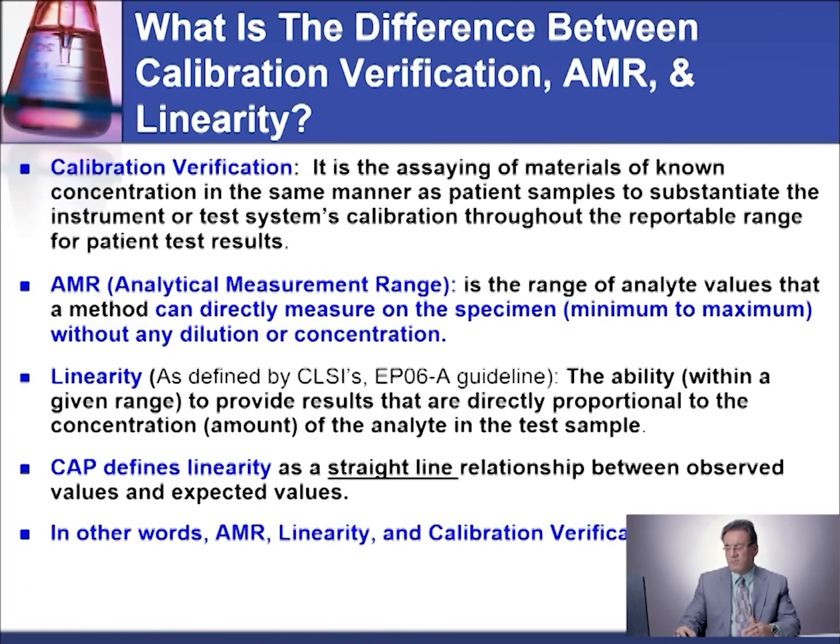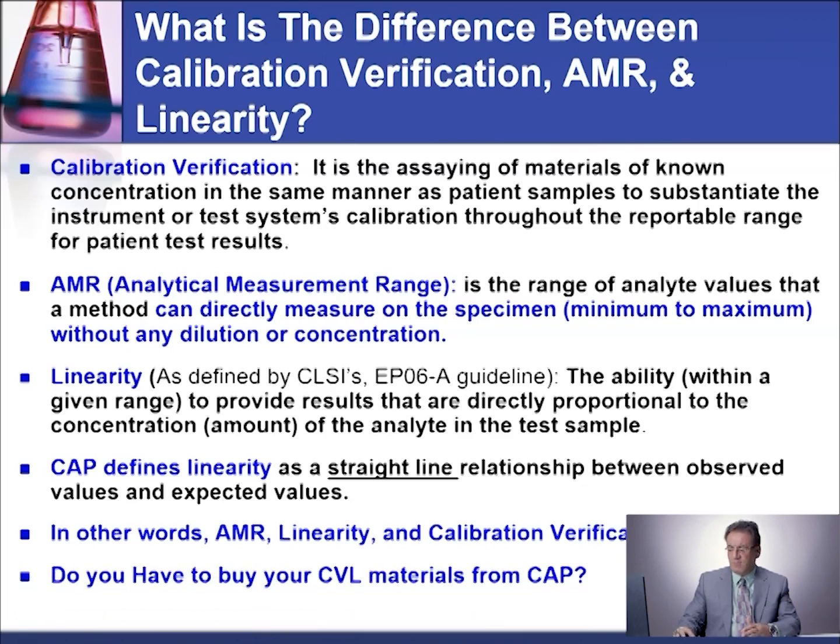In other words, AMR, linearity, and calibration verification all mean the same thing if the material you are using covers the range of the AMR.